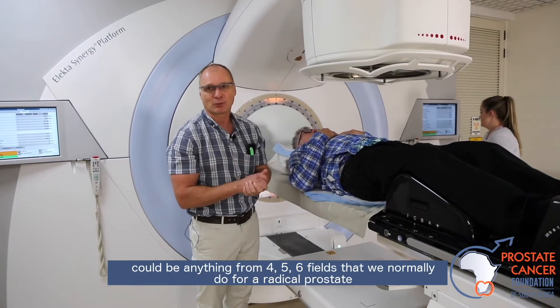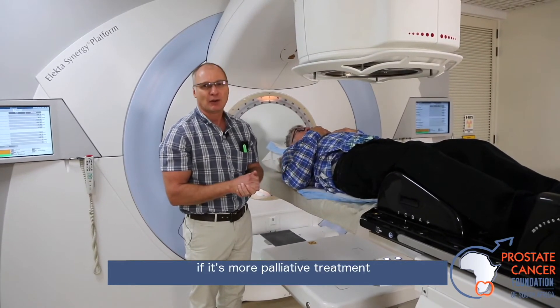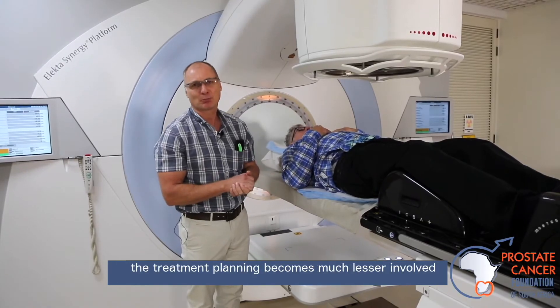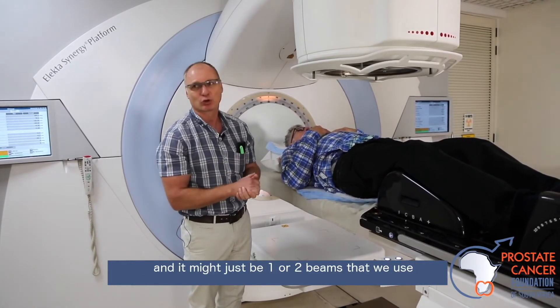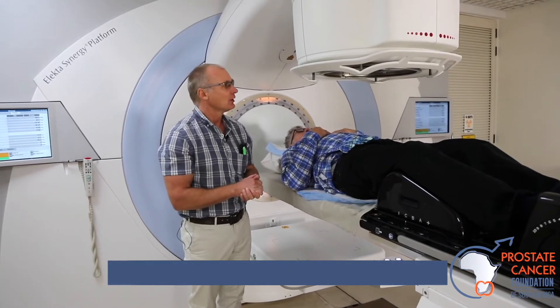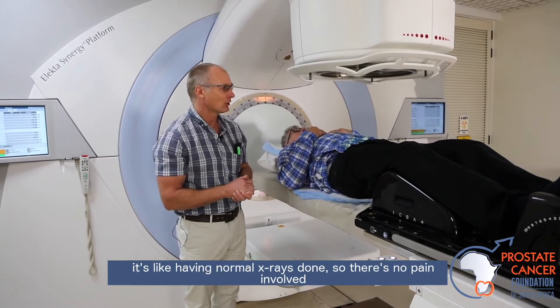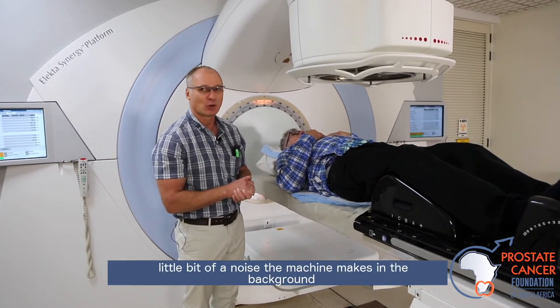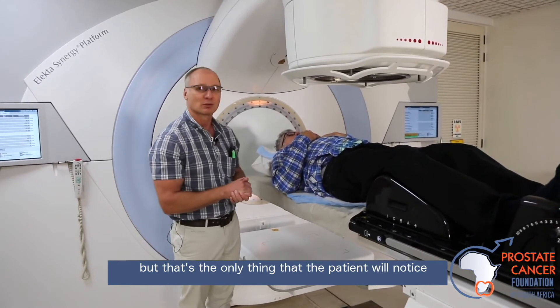It could be anything from 4, 5, or 6 fields that we normally do for a radical prostate. If it's more palliative treatment, the treatment planning becomes much less involved, and it might just be one or two beams that we use. The patient doesn't feel anything — it's like having normal X-rays done, so there's no pain involved, no discomfort, just a little bit of noise the machine makes in the background, but that's the only thing the patient will notice.